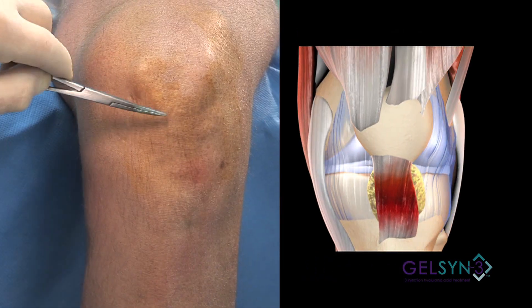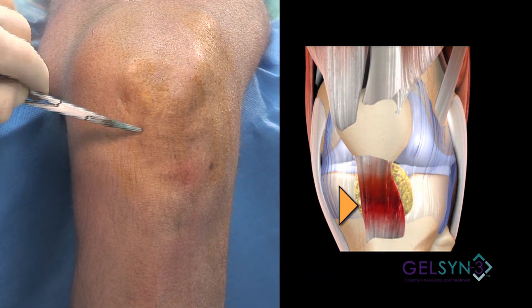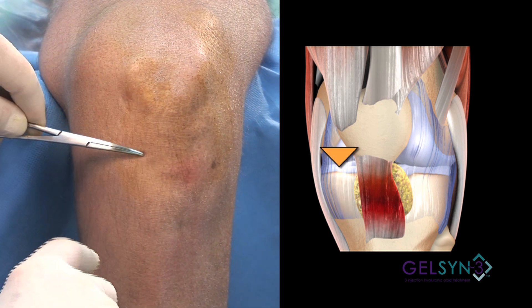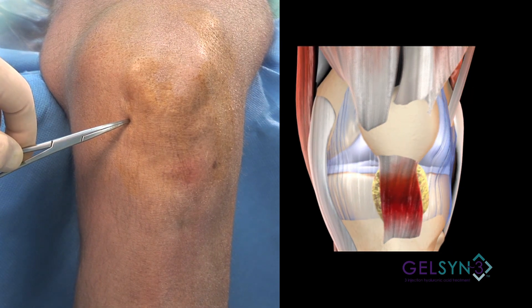Here's the patella and the inferior patellar pole. Now the medial border of the patellar tendon. We can palpate the upper margin of the tibia. And again we're going to aim for the intercondylar notch.